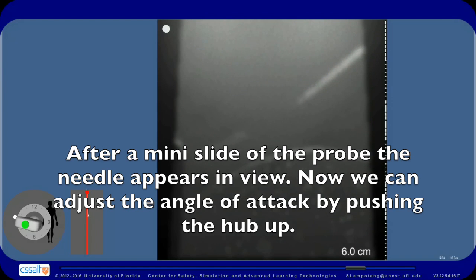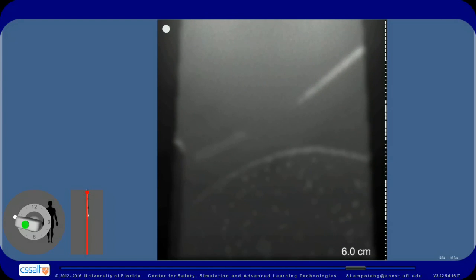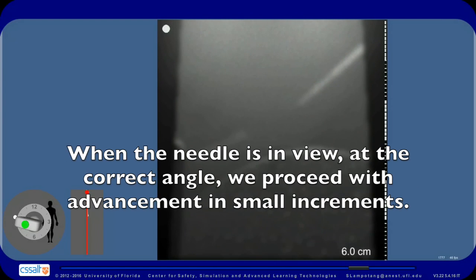Now we can adjust the angle of attack by pushing the hub up. When the needle is in view at the correct angle, we proceed with advancement in small increments.